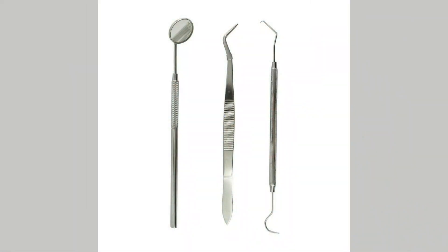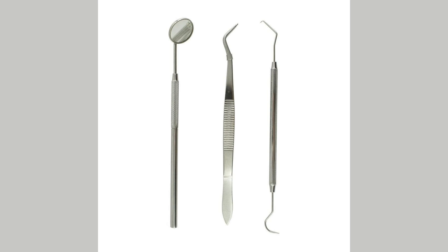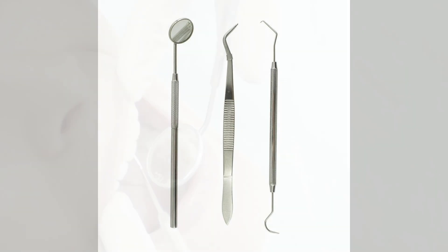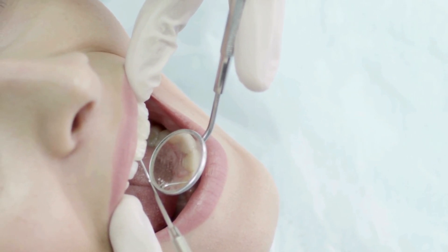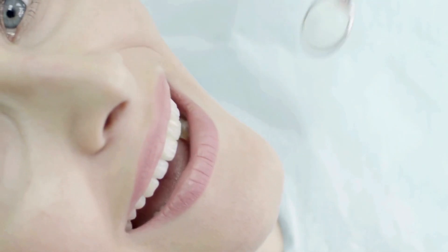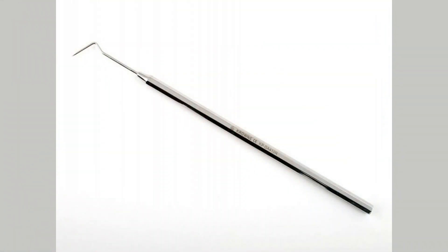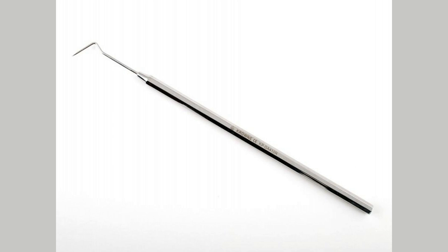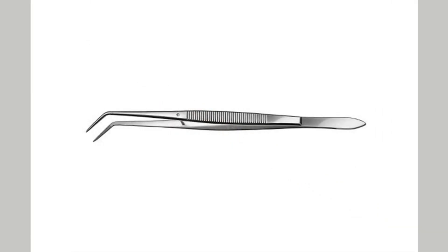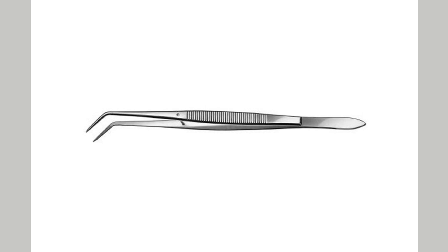Examination set: the mirror, probe, and pressel trio are needed at the beginning of the examination and used with all patients — this is called the examination set. The mirror consists of a small oblique mirror attached to a thin handle made of metal or durable plastic; it is used to visualize the structure of the mouth and teeth. The probe is a tool that can be pointed, flat, or sickle-ended, generally used by dentists for diagnostic purposes. The pressel is a tool that allows placing small objects such as cotton rolls into the mouth and carrying small objects out of the mouth.